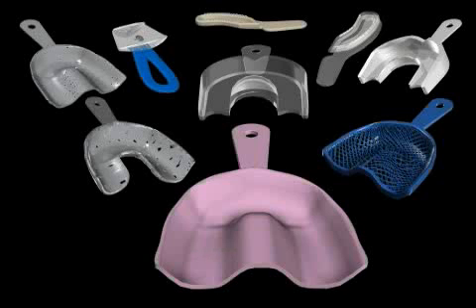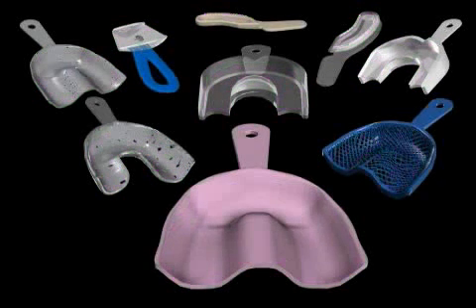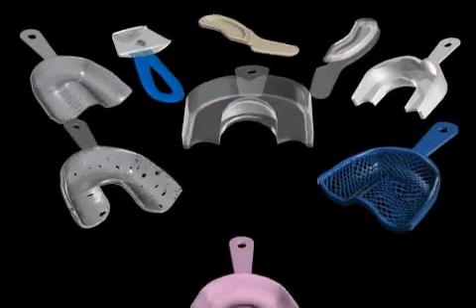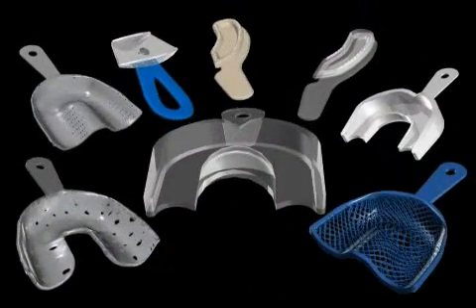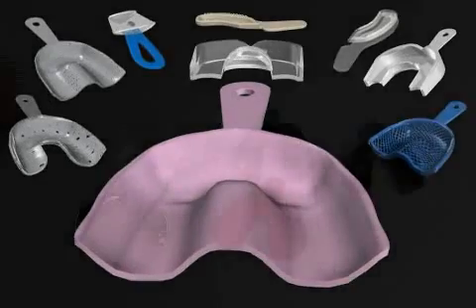Impression trays are used to carry impression materials when dental impressions are taken. We distinguish between two types: prefabricated and individualized. In the image above, you see several different types of prefabricated impression trays. At the bottom of the image, we have individualized impression trays.